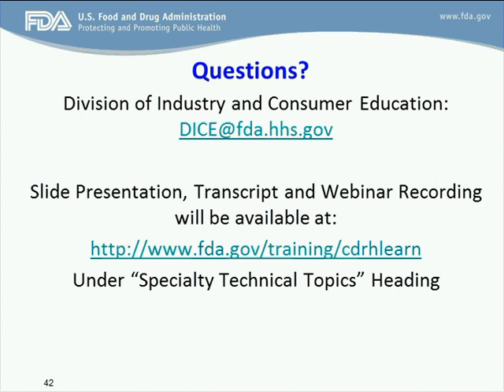I was hoping that you would be able to help clarify a description in Section 8 on the various test types that are used to validate cleaning. When the guidance states that at least 2 quantitative test methods should be used, do you mean that for each soil indicator, say protein, carbohydrate, and hemoglobin, 2 quantitative methods should be used to assess residual levels of those indicators? Or are you saying that only 2 indicators need be tracked, and for each of those 2 indicators only 1 quantitative method be employed? Or are you saying something different than either of those 2 descriptions?